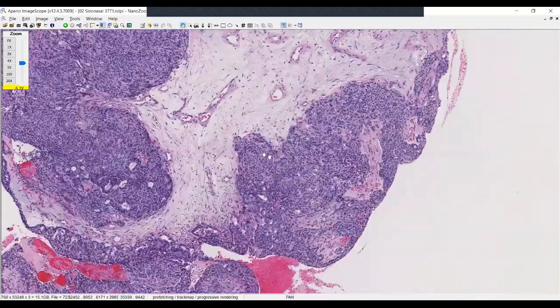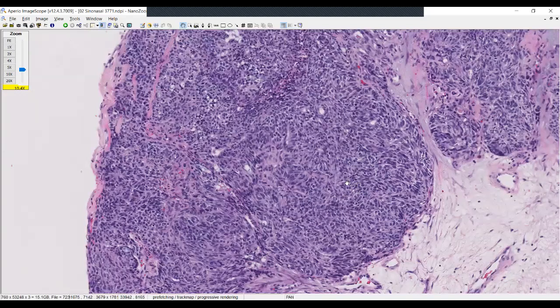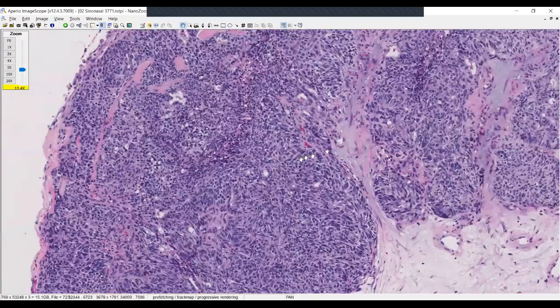Now, in general, a tumor like this has an overall squamoid appearance. It's transitional, obviously, as an epithelial type, but has more of an overall squamous appearance. And so I would call this particular tumor a poorly differentiated non-keratinizing squamous cell carcinoma.